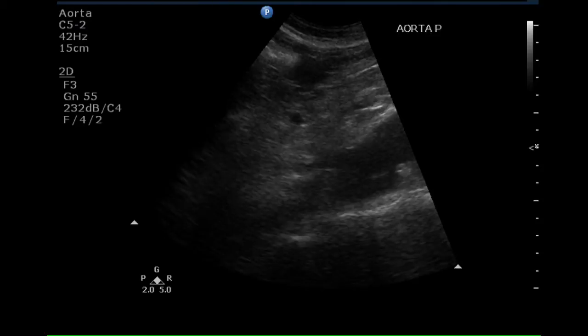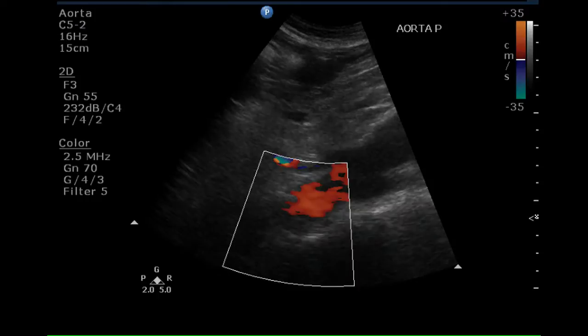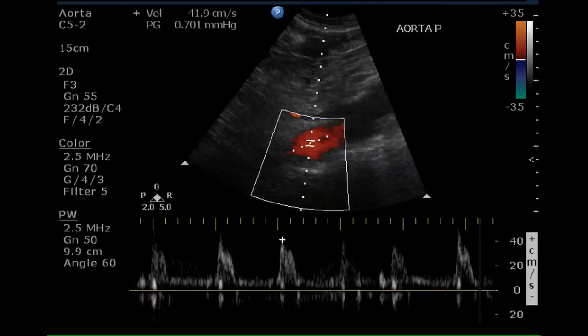This is a sagittal image of the proximal aorta. A portion of this vessel cannot be seen due to interference by air in the esophageal-gastric junction. Color Doppler can be shown in this portion, the proximal portion of the aorta.